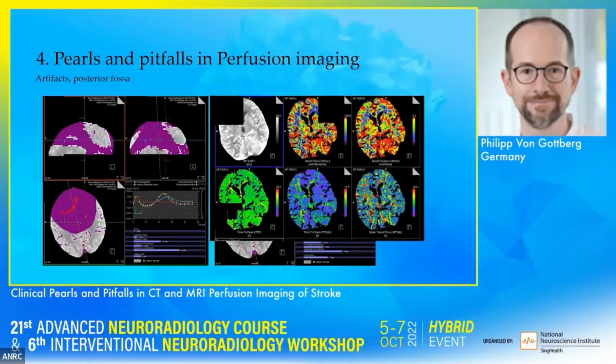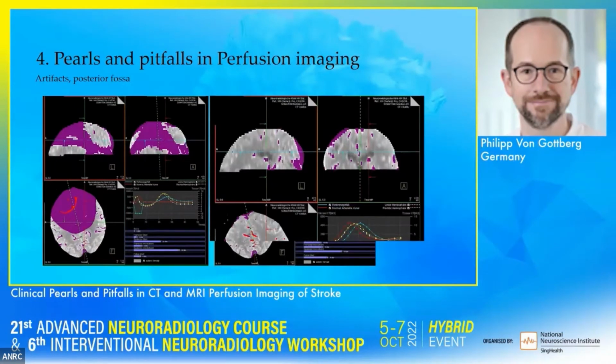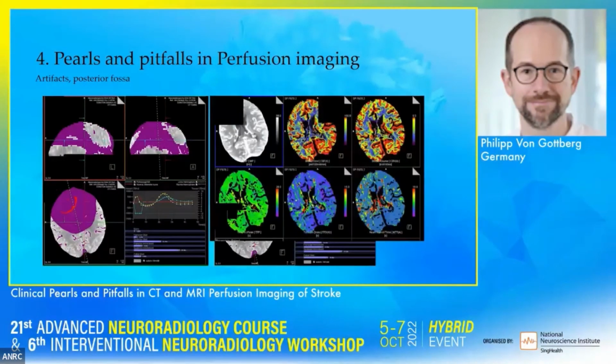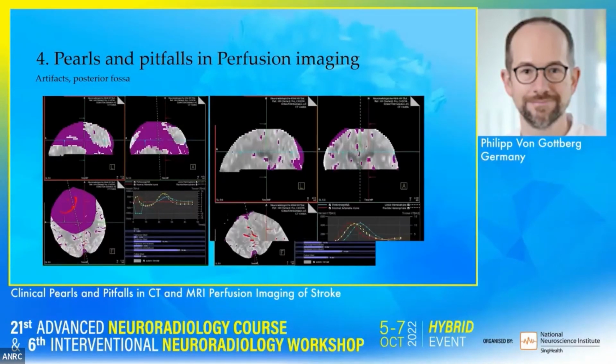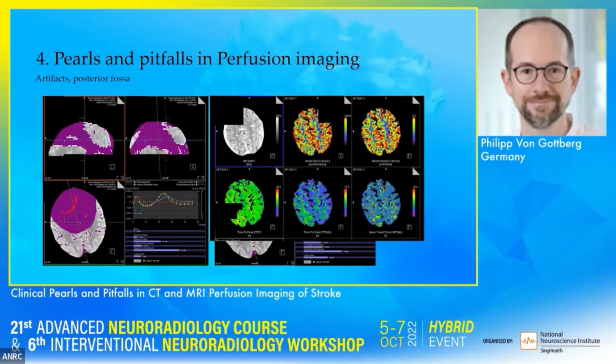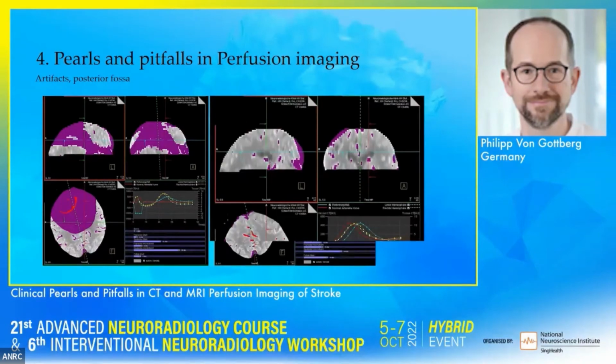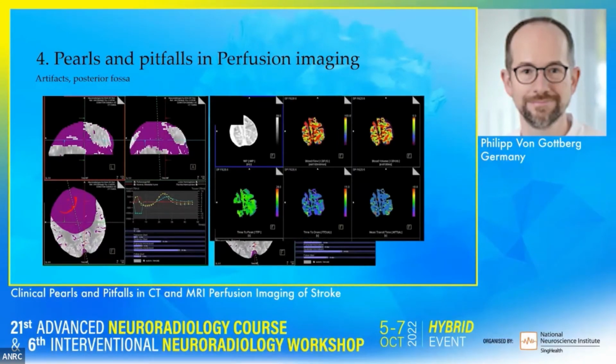Sorry for these black boxes, this is for anonymization, but you can see in this very patient, after correcting the images, and this is one of the pearls, if you just go manually into the evaluation of your data, you can still rescue this quite heavily affected examination, which is heavily affected by movement artifacts.